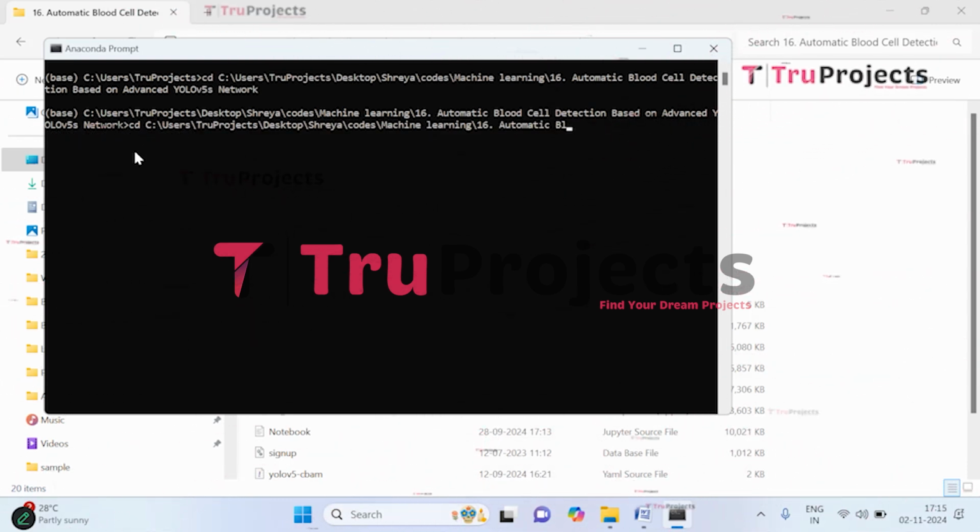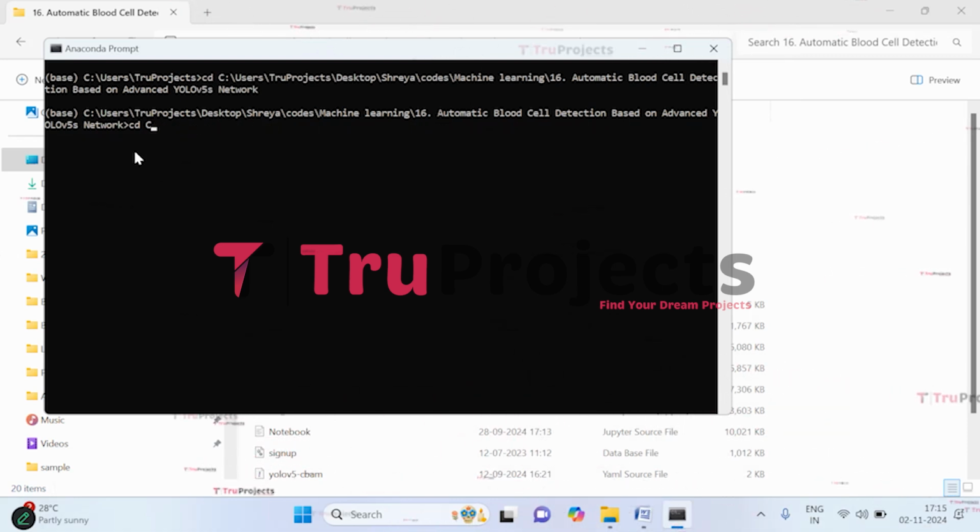We have entered it wrongly. Just give me a minute. Let's enter it again. Now click on enter.